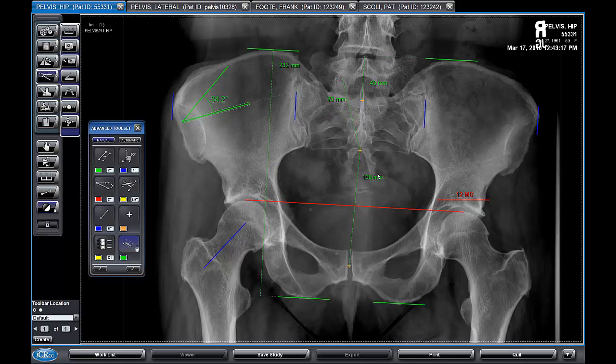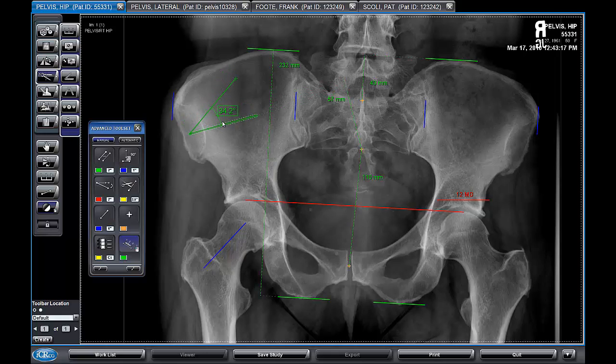These measurements are dynamic, so as we change the positions of the objects that we're measuring, the corresponding distances will change as well.